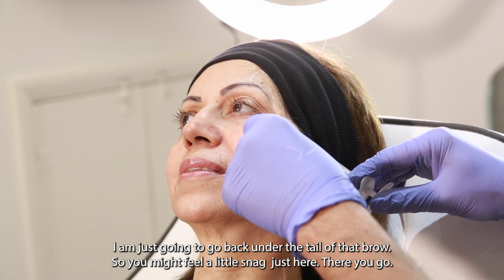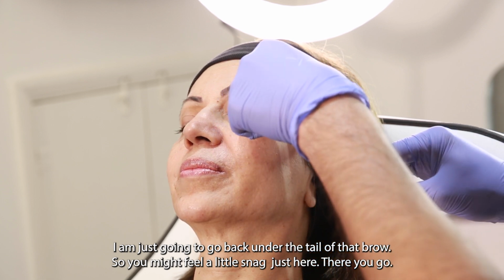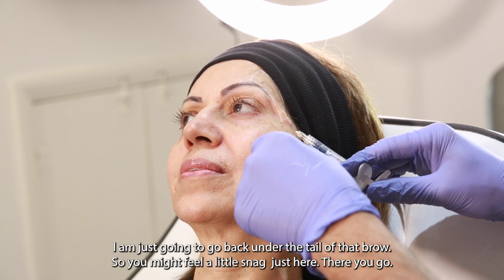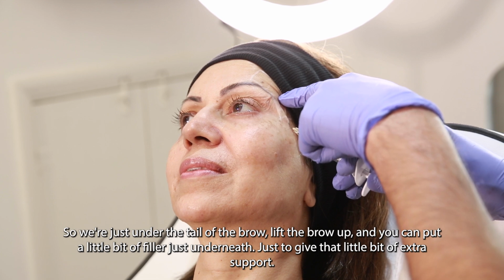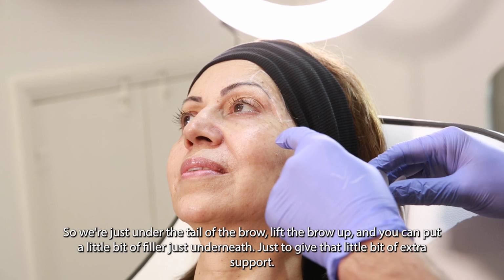I'm just going to go back under the tail of that brow, so you might feel a little snag just here. There we go, so we're just under the tail of the brow. Lift the brow up, and you can put a little bit of filler just underneath, just to give that little bit of extra support.